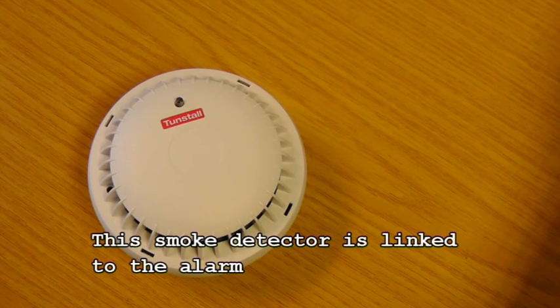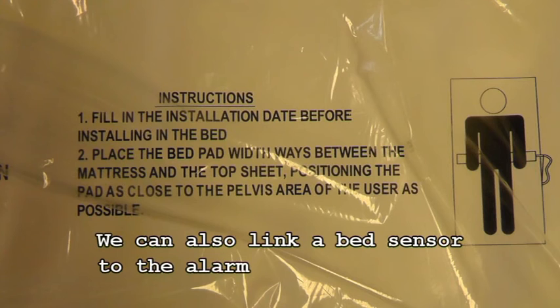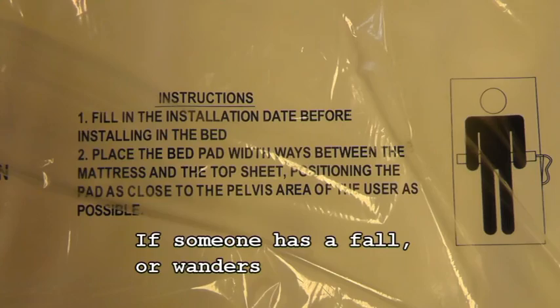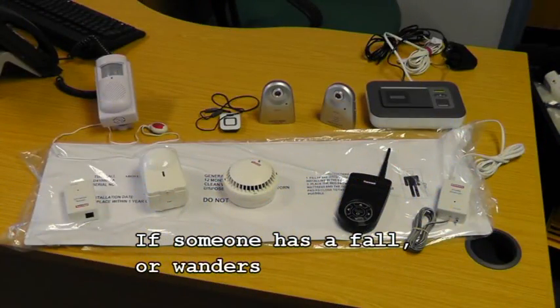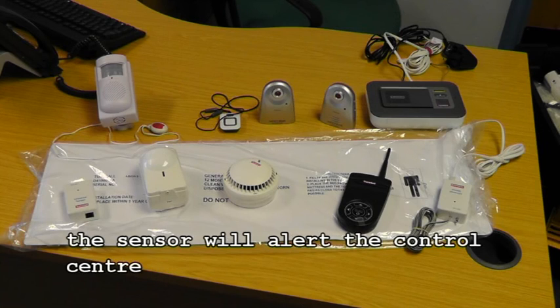We also have a smoke detector, which could be linked up also to the dispersed alarm. The dispersed alarm could also be linked to a bed sensor, which again would be for people who have got capacity issues. We set times into it from 10 o'clock at night, for example, until 7 in the morning, with a 20-minute absence period. If they don't return back to their bed within that 20 minutes, it will automatically send a call through to the call centre, because maybe they've had a fall, or maybe just that they're taking a wee bit longer, but we can actually speak to them through the box once that's been alerted.